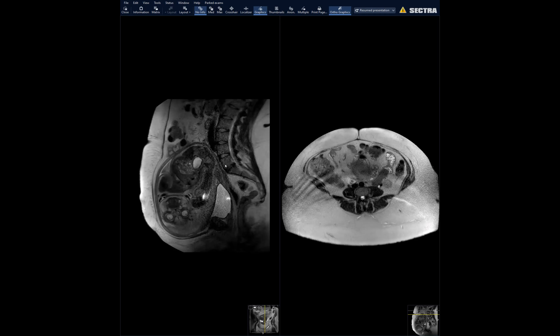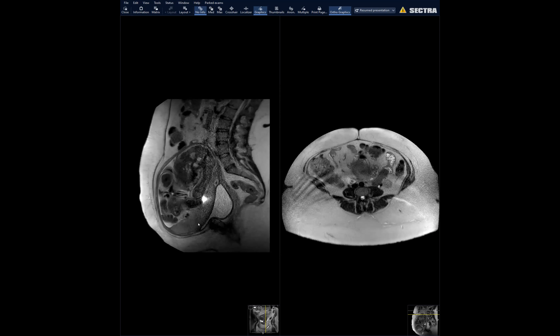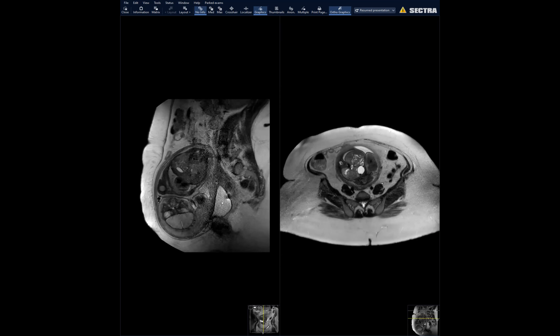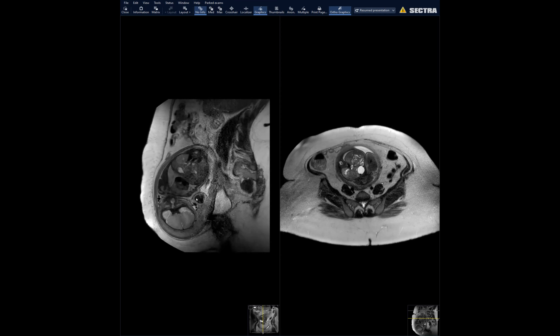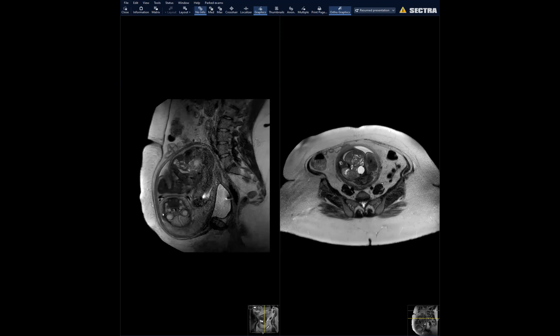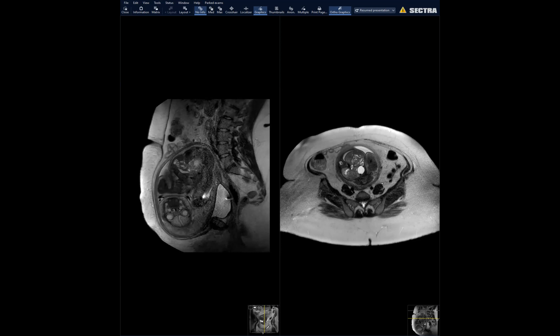There is mention of anterior uterine incarceration in literature, as a contrast to posterior incarceration, where the uterus gets stuck between the pubic symphysis and sacral promontory. For anterior incarceration no such formal definition was found, but it is creating significant mass effect and has come anterior to the bladder. This may be contributing to IUGR due to insufficient space. Fortunately, she was already at 36 weeks, a cesarean section was performed, and both baby and mother are doing well.